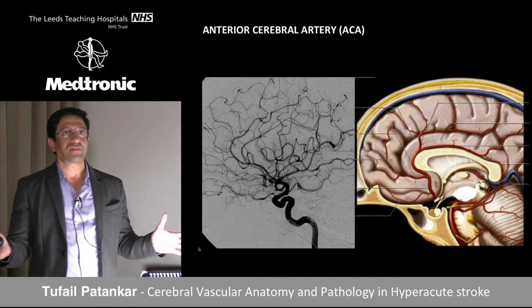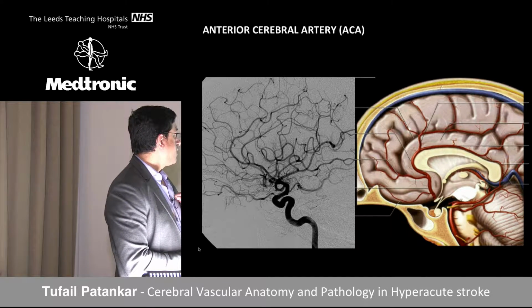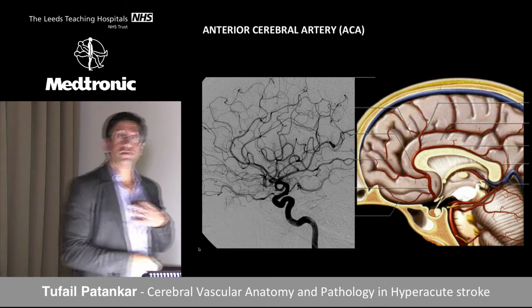Everybody's happy with that? So just going to ask you that, so on the left slide, where your pointer is, that internal carotid artery, now going on the right side is the middle cerebral artery, so going up, this way. Yes, that's right. So that's almost equal to the size as ACA as well. So, yeah. Can that happen? You can't differentiate from the size.